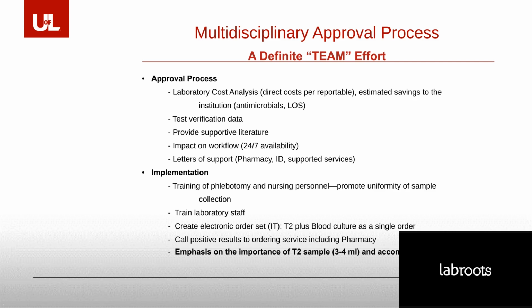We will give them 45 minutes flexibility from the time the T2 is collected to the time the blood culture is collected. But if it's more than 45 minutes, let's say an hour, the T2 test is rejected.